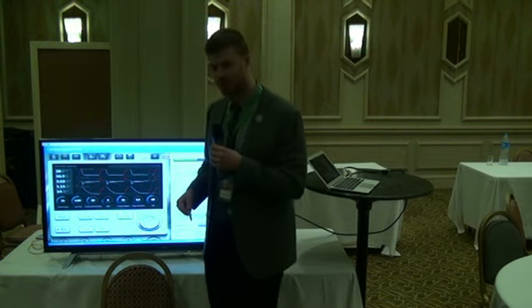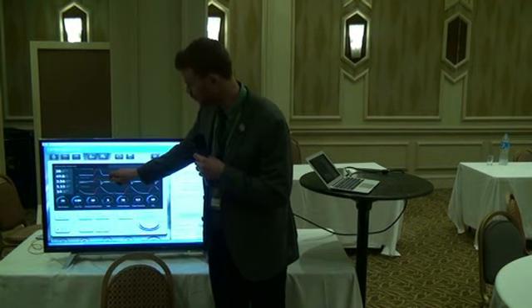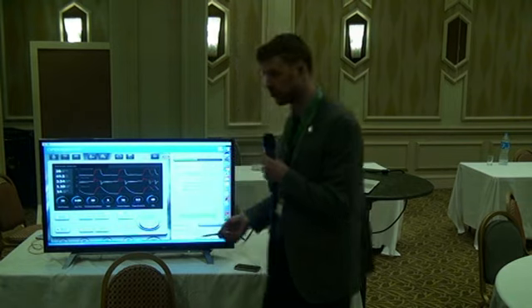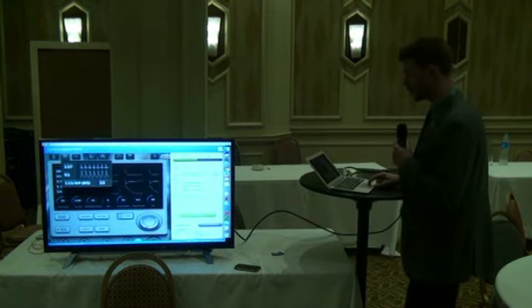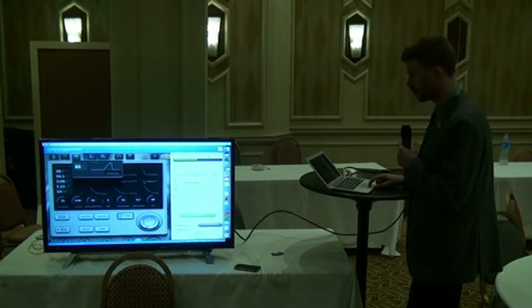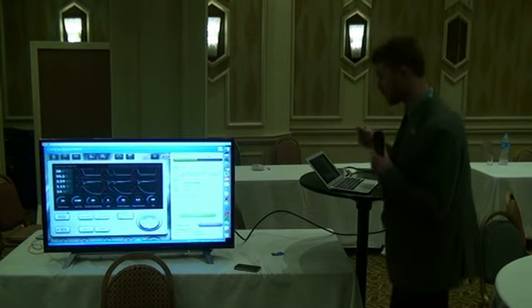Good point. I should probably tell you what you're looking at first. The top waveform is pressure, then flow, then volume. That's usually how the ventilators I've used are set up, but sometimes it can be different, or you can change it. We can also look at the physiologic parameters. We get an ECG, SpO2 pleth, so heart rate, saturation, blood pressure, and total respiratory rate, as well as the end-tidal CO2, where we get the actual value here of 80, and we can look at the capnogram itself. Okay, so what looks weird?